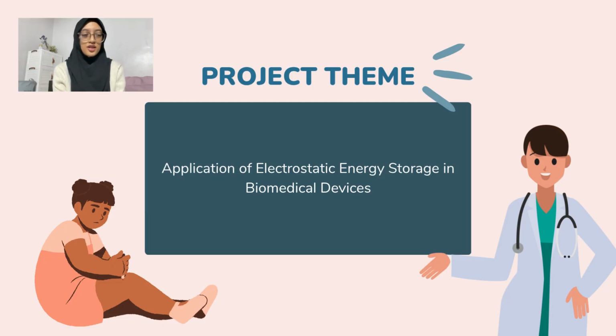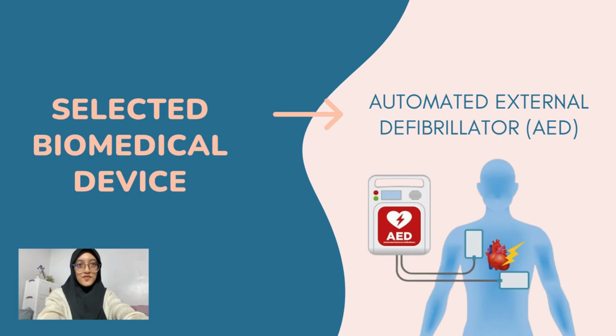Throughout this presentation, we will explore how this concept is practically applied in real biomedical devices. For this project, we have selected the automated external defibrillator, or AED, as our focus device. An AED is a portable, life-saving device used to treat sudden cardiac arrest. It works by analyzing the heart rhythm and delivering an electric shock to help the heart establish an effective rhythm.